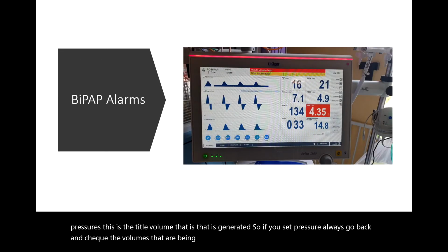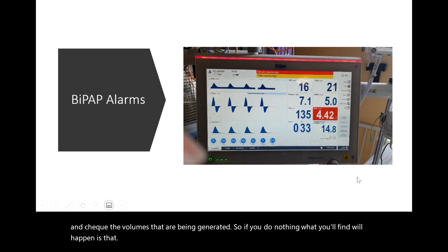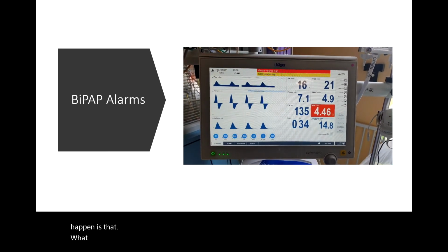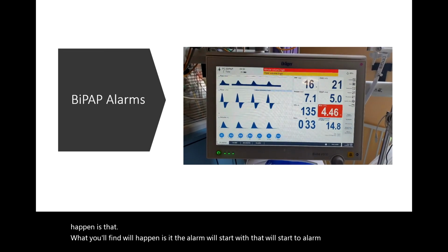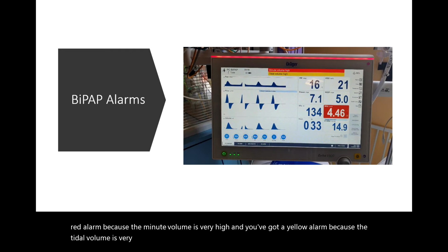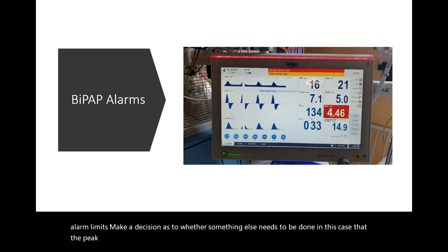If you do nothing, what you'll find is that the ventilator will start to alarm. You've got a red alarm because the minute volume is very high, and you've got a yellow alarm because the tidal volume is very high. So obviously when you see those sorts of things, don't just adjust the alarm limits, make a decision as to whether something else needs to be done. And in this case, if this were attached to a real patient, the peak pressure would need to be reduced.